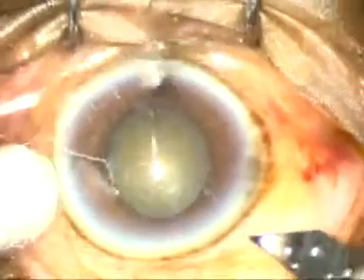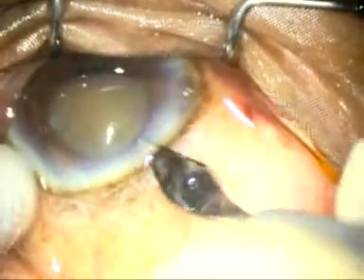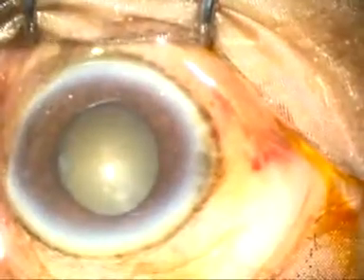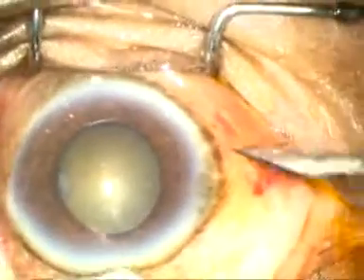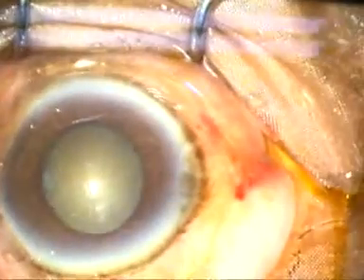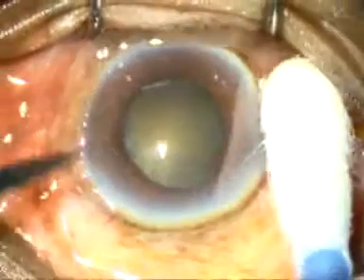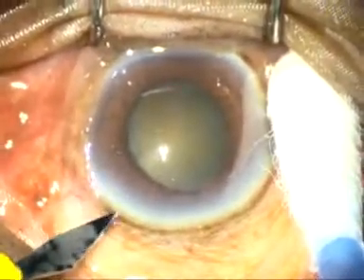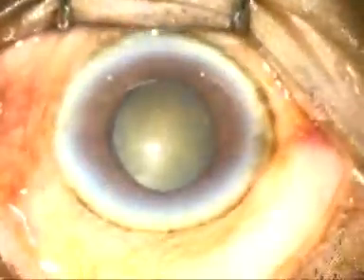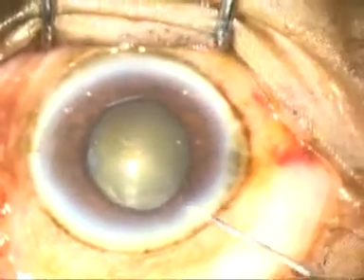This is a 2.8 millimeter main incision. Now 2 side ports are to be made — one on the right side and one on the left side. Note that the eyeball is supported by a cotton-tipped bud, and at no point of time is a toothed forceps used; that is to prevent subconjunctival hemorrhage.